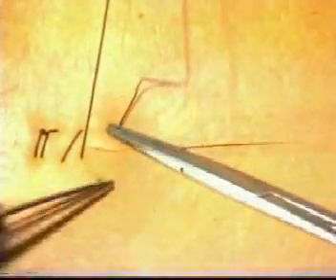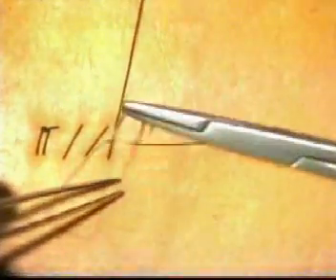Work along the wound each time ensuring the same tension and then hand it to your assistant who maintains that tension.